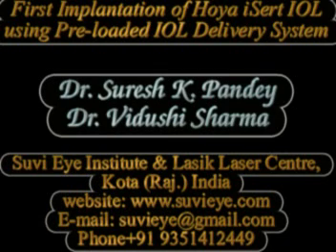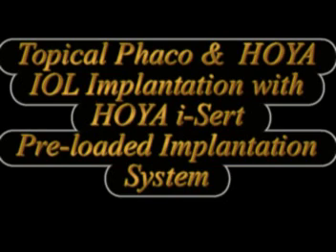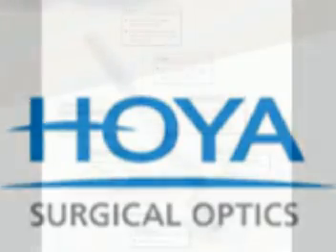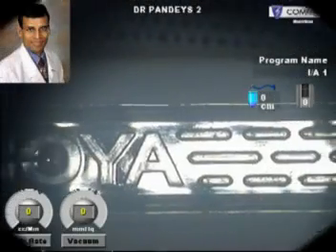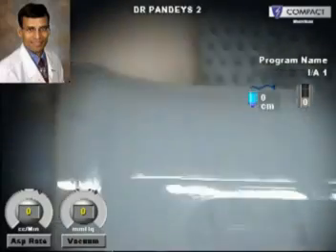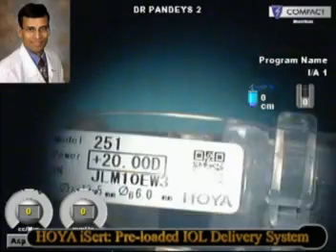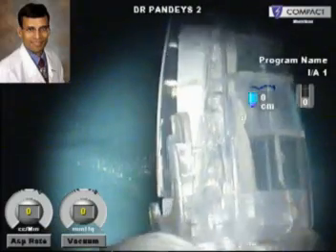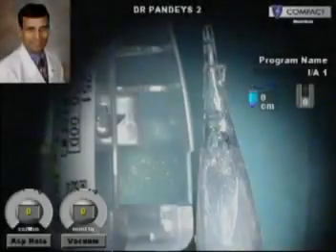Hi, I'm Dr. Vidushi and in this video from Kota, Rajasthan, India, we demonstrate the implantation of a Hoya Aspheric Hydrophobic Acrylic Lens using their proprietary ICERT preloaded IOL injector. This is the Hoya ICERT preloaded IOL injector system for implanting a hydrophobic acrylic IOL through micro incisions of 2.5 mm or less. This is the first such implantation of a Hoya preloaded IOL in India, as these IOLs have only recently become available in the Indian market. Hoya was the first company to launch a preloaded IOL in the US market.